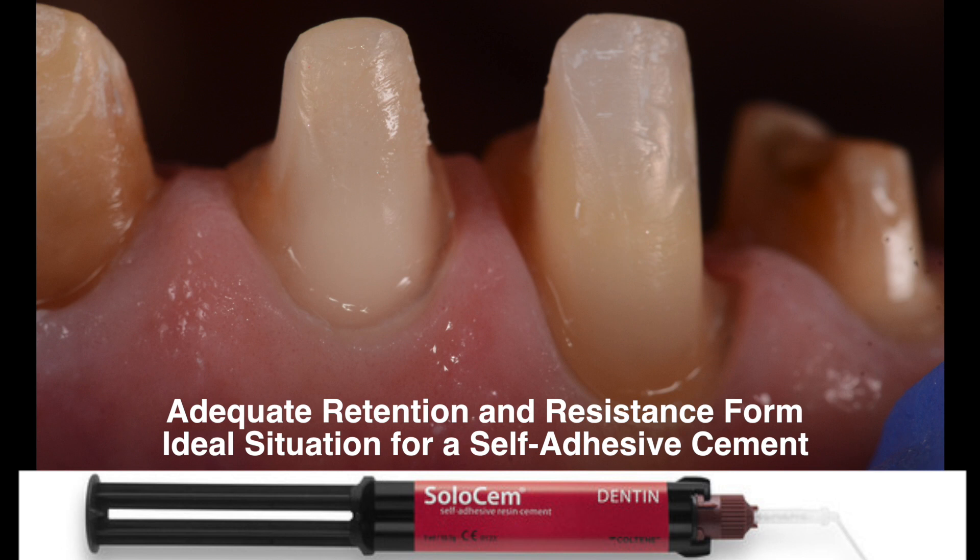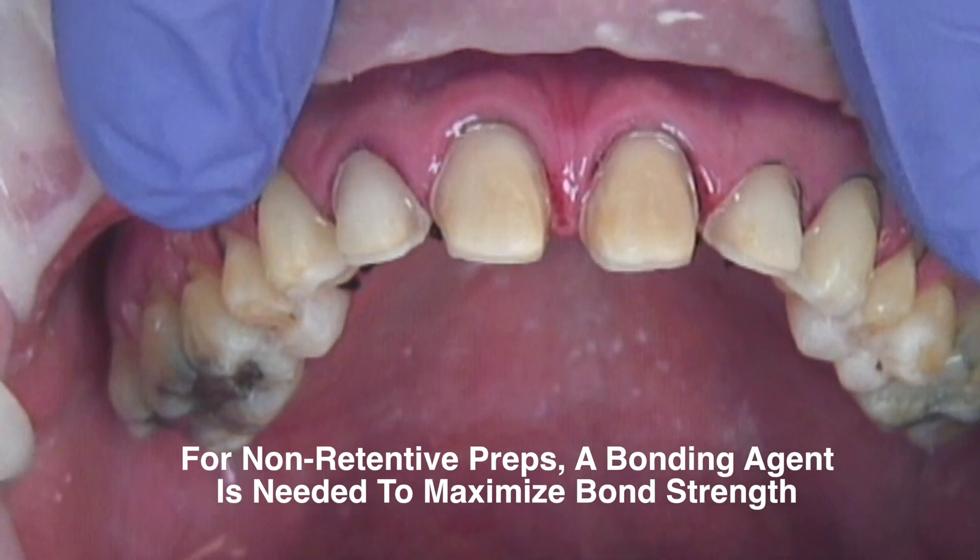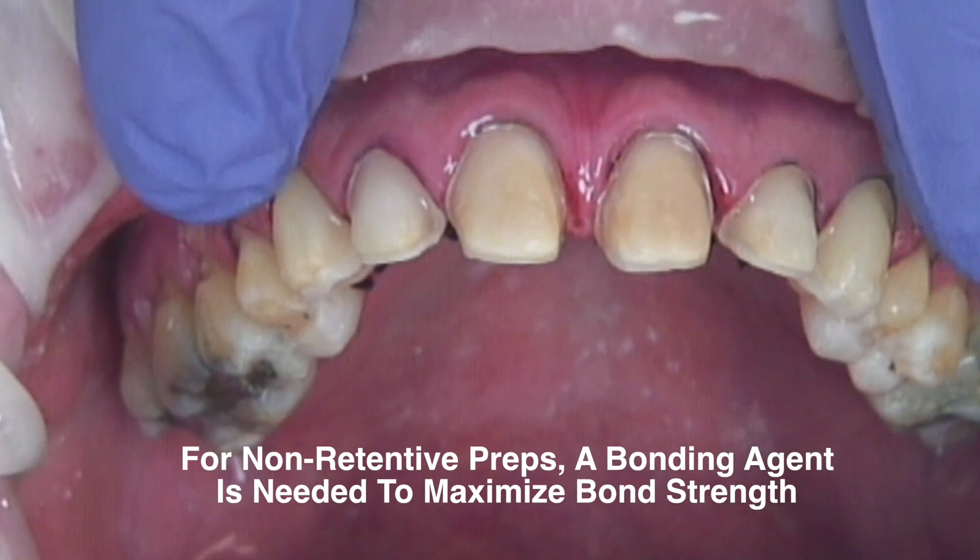When a bonding agent is applied to the process of adhesive cementation, the bond strength between the tooth and the restoration is significantly increased.